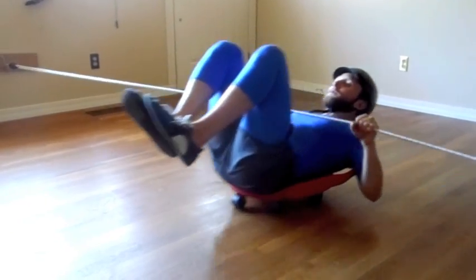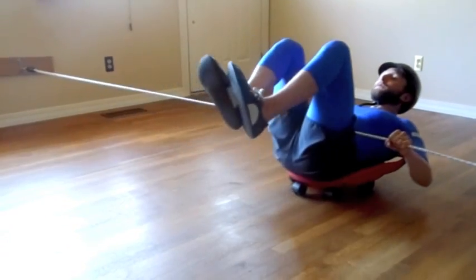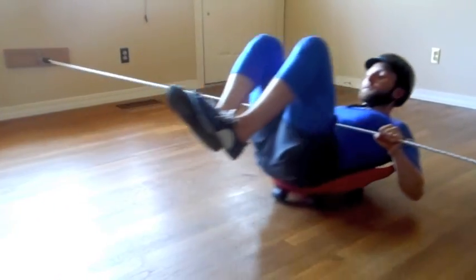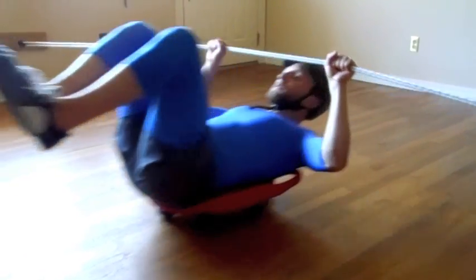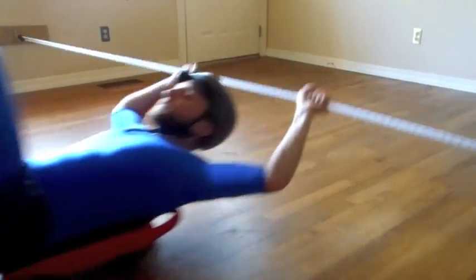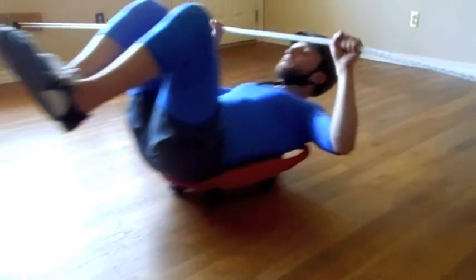We recommend using a helmet at all times. Completion of these exercises, activities, and games should be done under supervision at all times. Consultation may be needed prior to starting a bungee scooter board program to determine benefit and appropriate setup. Proceed with caution — failure to practice sound clinical judgment may result in injury.